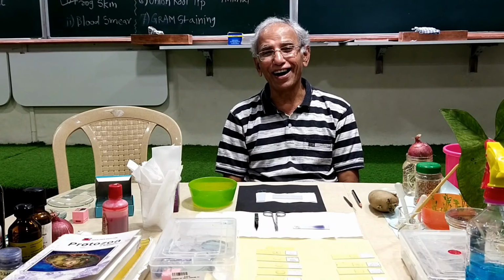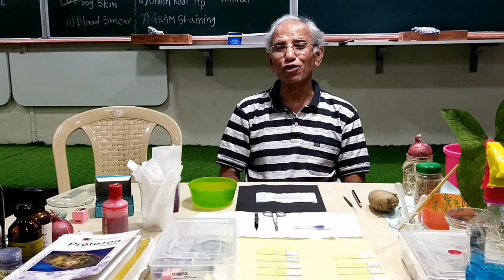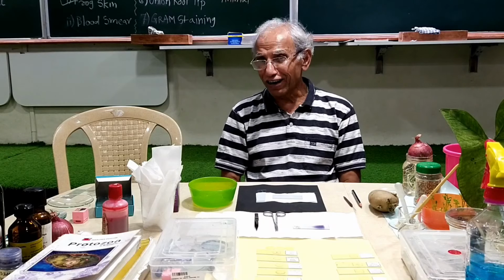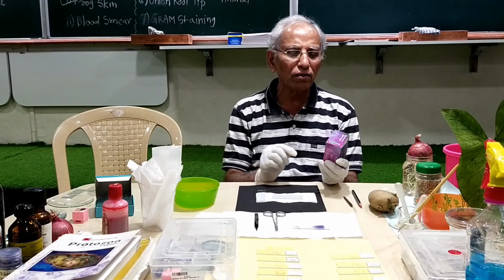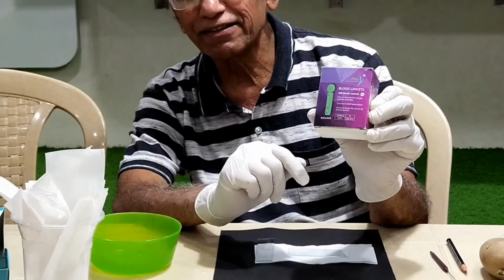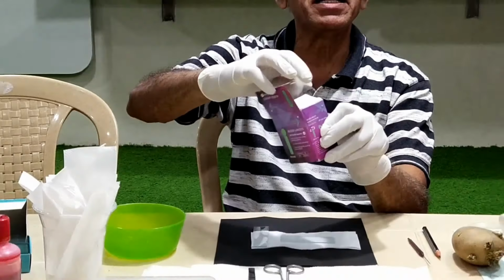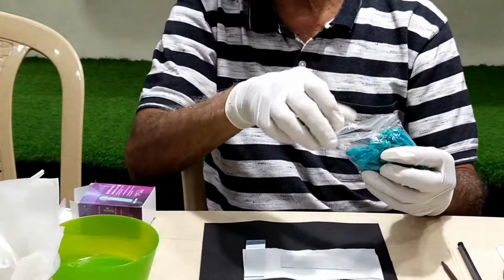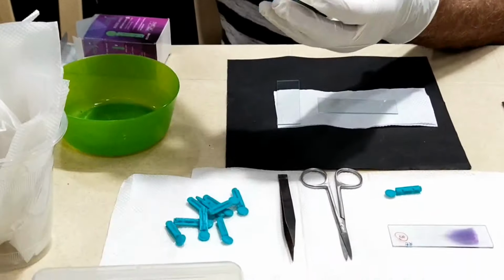Well, I'm sure someone of you who are observing the video will be able to come here and give a drop of blood on the slide. If not, let's have some alternative. The blood can be taken out with the help of blood lancets. Here is a box where you have many lancets. Can you see? This is a box full of lancets, and here I can just pour a few lancets for your observation. What is a lancet?